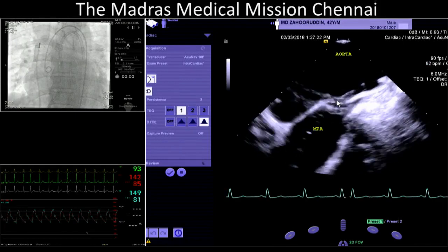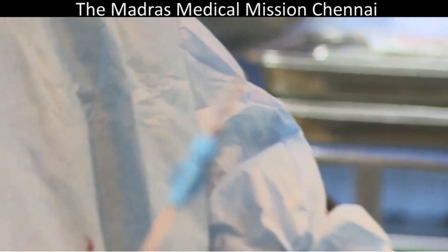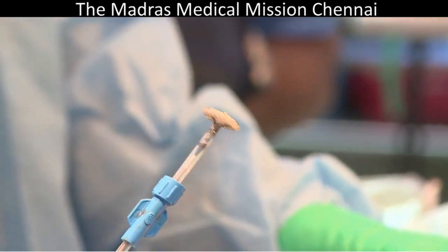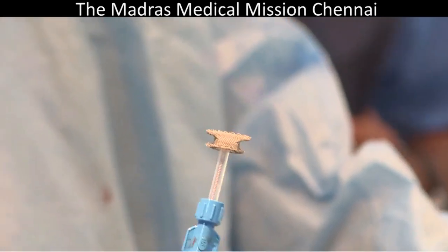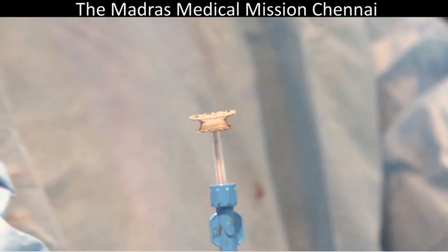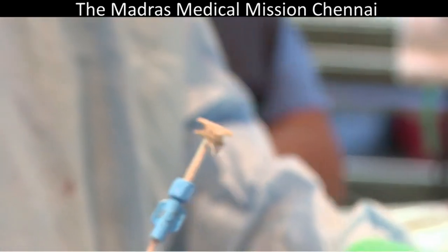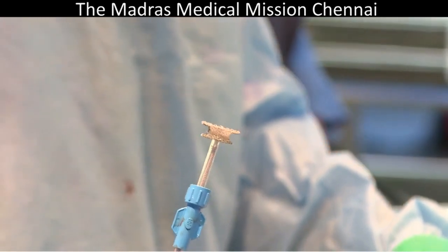I want to show the device we are going to use. Let me ask the auditorium: who has experience with APW closure? One person from Egypt. Oliver, how many patients? Four. Mario? Just one residual after aortic surgery. So very limited experience in the room.